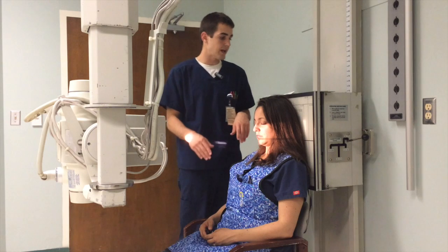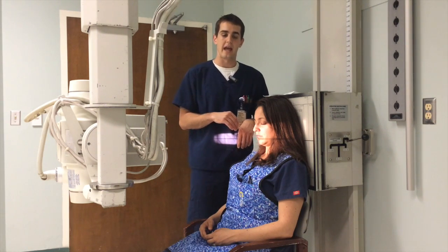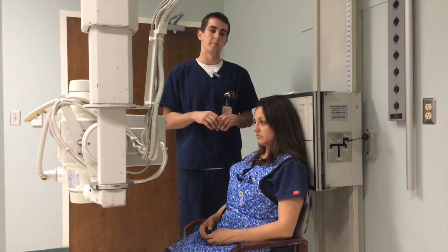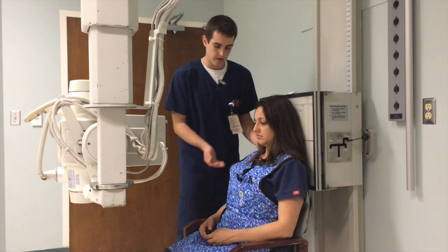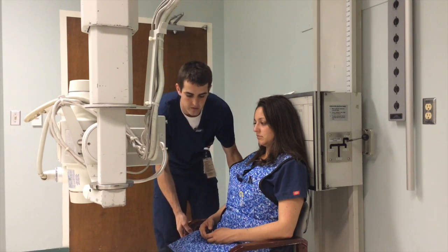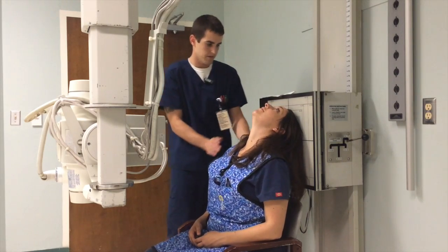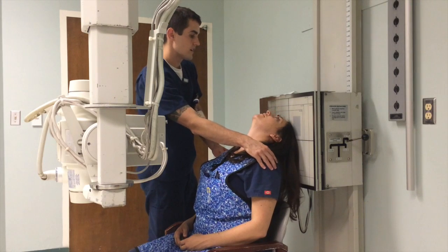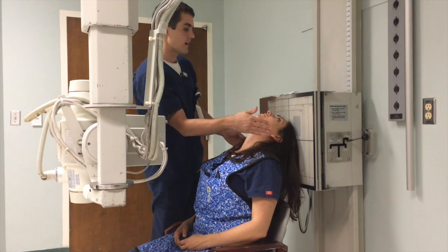We want our central ray 2 inch or 1 inch posterior to the outer canthus, and just like the previous view, it's a bilateral view of the zygomatic arches. So we're going to go ahead and scoot you forward just a little bit, and if you can tilt your head back, perfect. There you go. We're going to get the mid-sagittal plane perpendicular to the IR and also centered to the IR.